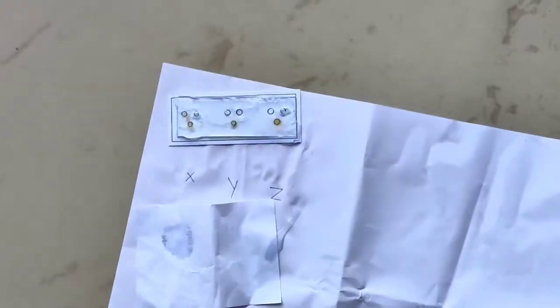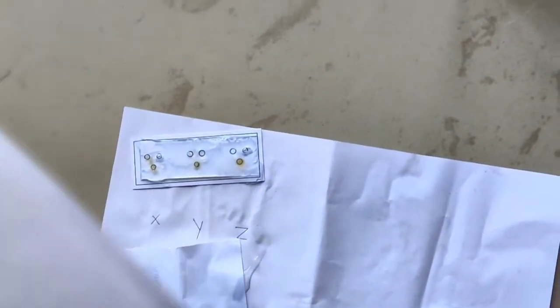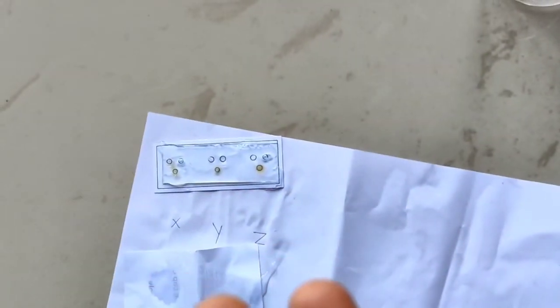Keep this glass plate in a moist chamber overnight at 37 degrees Celsius.